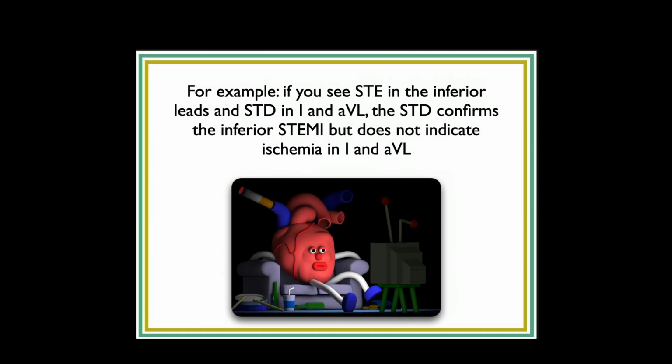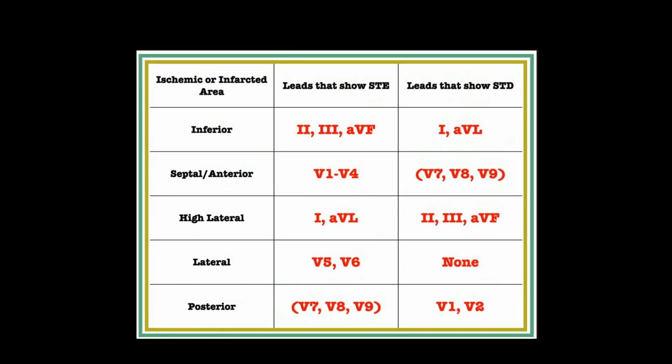In fact, that's what it says on this slide. If you see ST elevation in the inferior leads, the ST depression confirms the inferior STEMI. Again, this is old news, but it's a summary of what we already know: this is where the ST elevation is, and this is where the reciprocal changes are going to be.